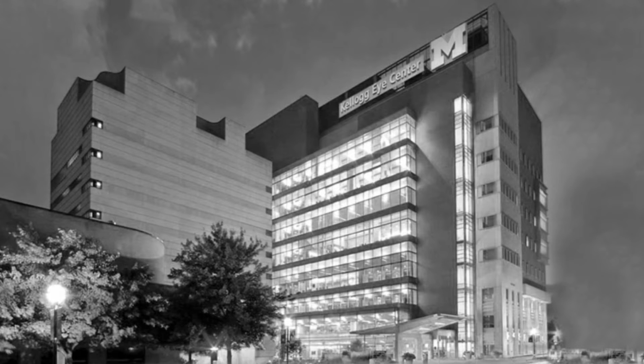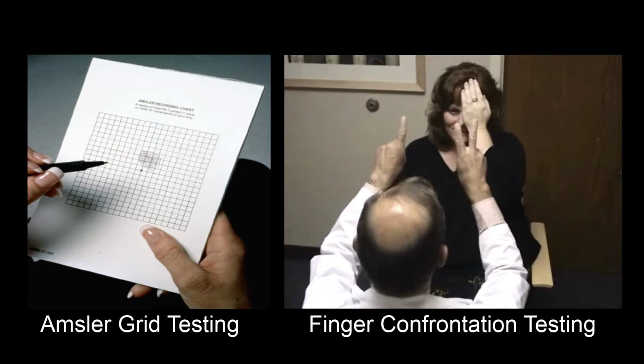Visual field testing is an assessment of the panorama of achromatic vision. It complements the assessment of visual acuity, which measures only the central degree or two of the visual field where the cones provide high resolution and color vision. You will do informal visual field testing by using the Amsler grid and by finger confrontation.